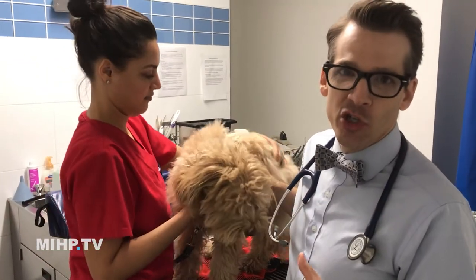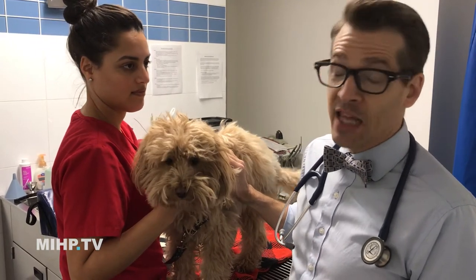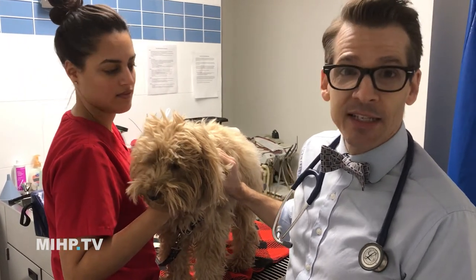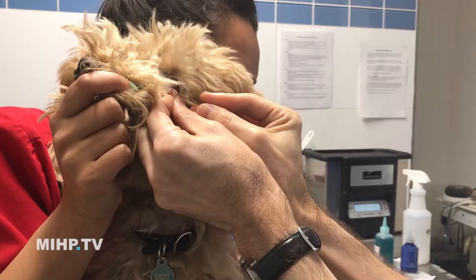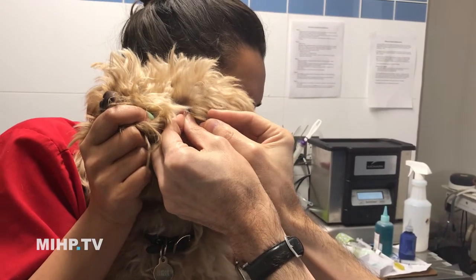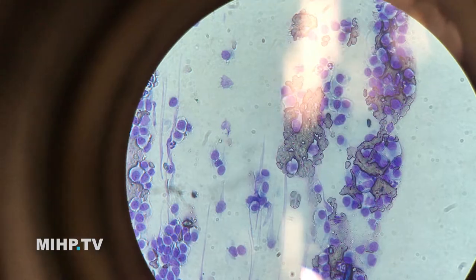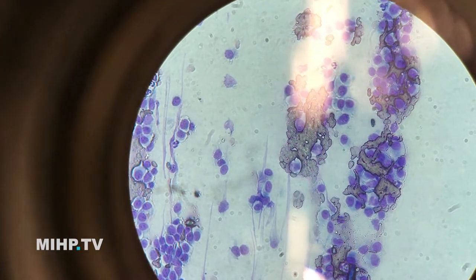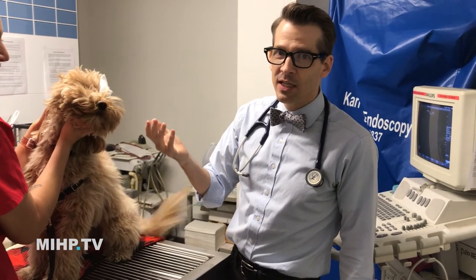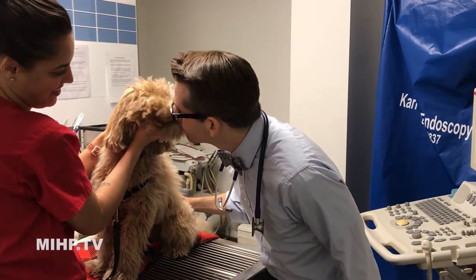If anybody tells you they can tell you 'I know what that lump is' without doing a biopsy, they're lying. They can guess, but it's just a guess until you get some cells. Almost done — brilliant! Good, hardly anything, but that's all we need. Even by the eye it's not a big deal. So when your vet says let's do a needle biopsy or a needle aspirate, it's easy. Good job!